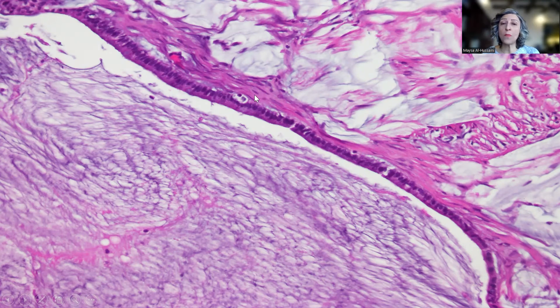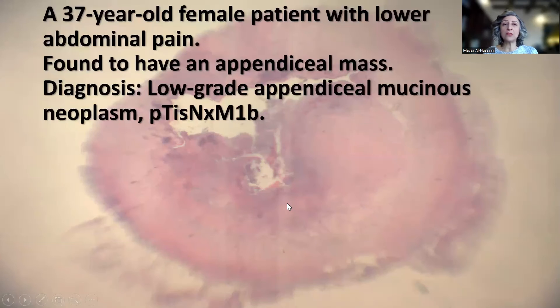Another focus showing this very nice lining of a gland or strip of epithelium lining parts of the fibrous tissue in the omentum, and then we have the lakes of mucin identified.